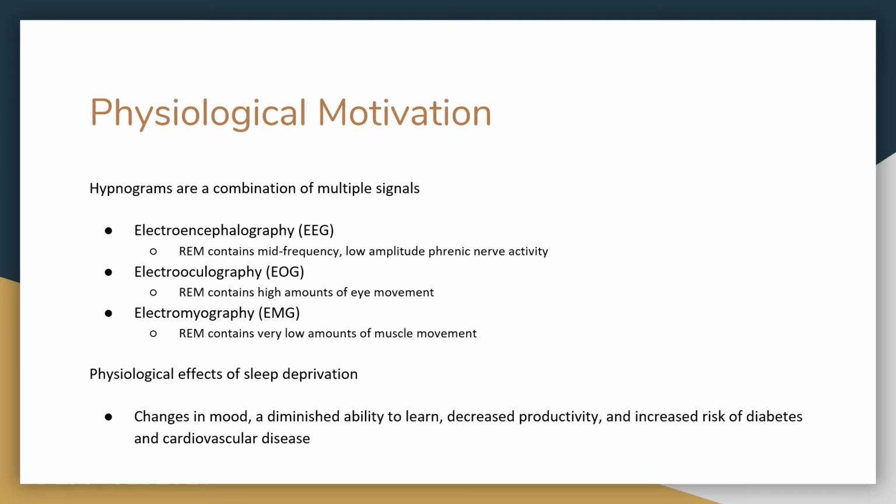EEGs are devices that measure brain activity and frequency of the signals. During REM, mid-frequency low amplitude waves are present. No K-complexes or sleep spindles are present during REM.